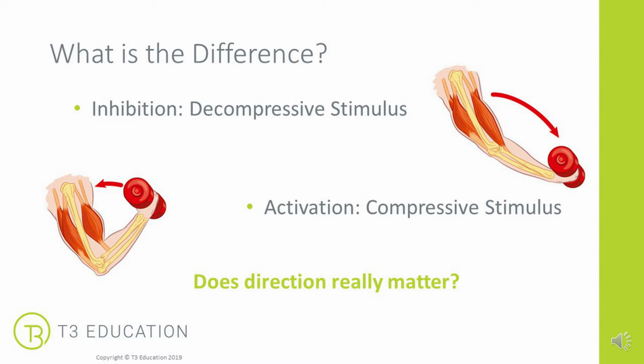If we consider the elbow here, where we're looking at that bicep movement, what we're looking to do with the tape is create length to open up that joint. So our taping and the direction that we use will be leveraging that recoil effect of the tape to create a pull on the tissue towards that distal point on the arm, to create that constant stimulus of opening and of lengthening.